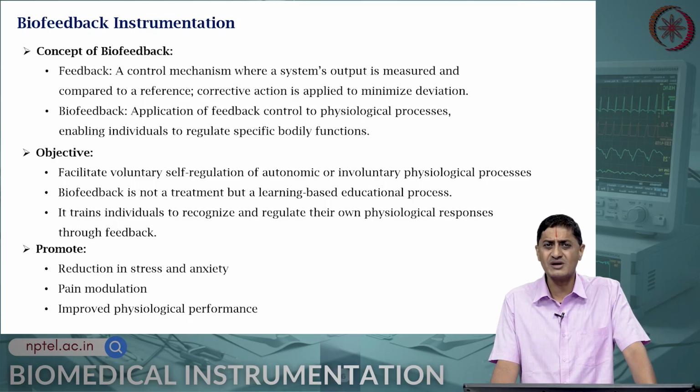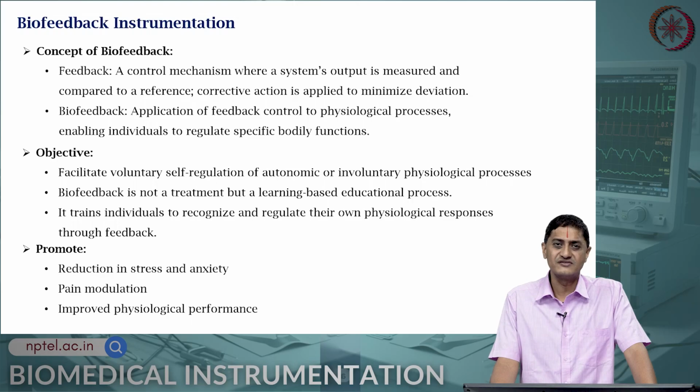Quite often this is used by athletes to improve their learning, and by people with ADHD or anxiety disorders to identify their own level of anxiety or level of challenge that they are facing, to accordingly adjust the output.